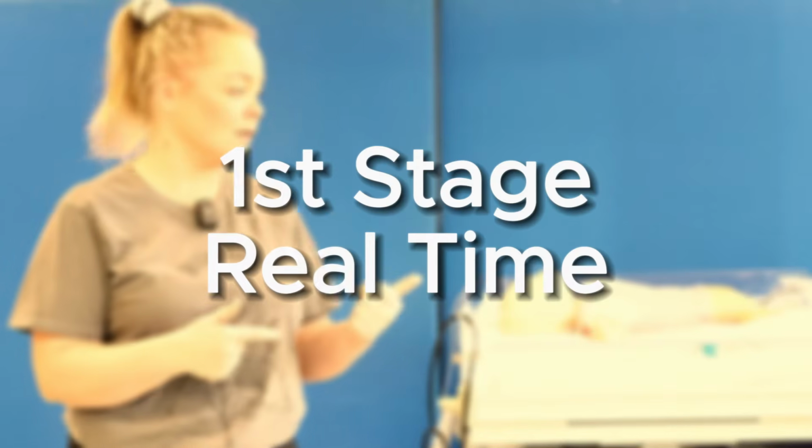What we're going to do is we're going to do it in a two-stage approach. The first stage, I'm going to do it in real time, and the second stage, I'm going to break it down so you understand why I've done what I've done and the rationale for it. So I'm going to get straight into the first stage.